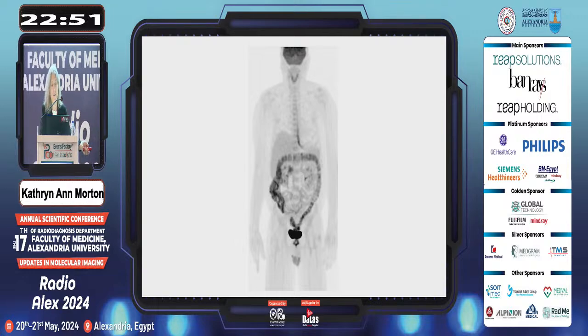Inflammatory lesions within the GI tract can be difficult to identify if there is uptake within those structures normally. So there is often some uptake in the mediastinum, in the esophagus. If it is fairly intense, it can signify an inflammatory process or potentially a neoplastic process.